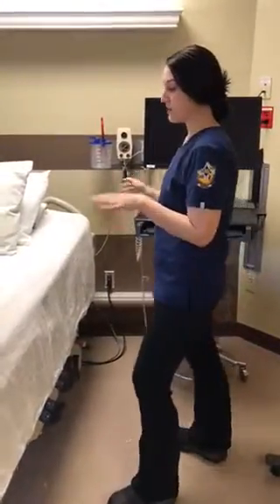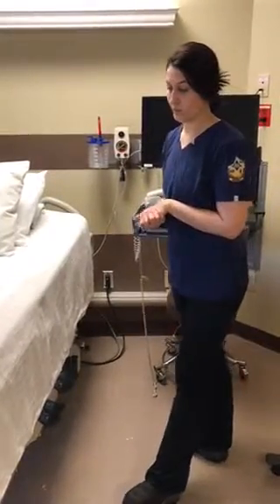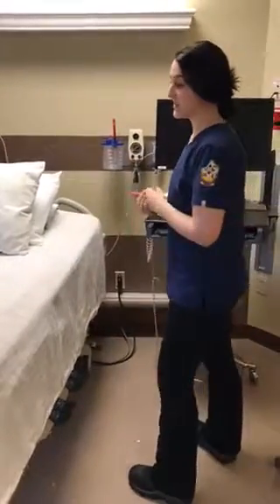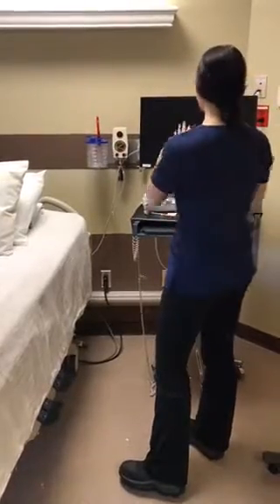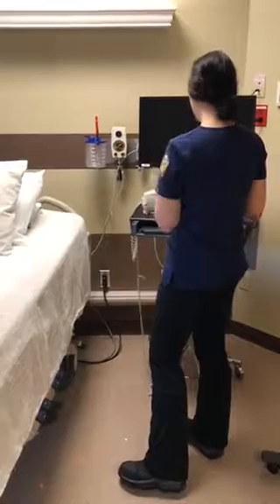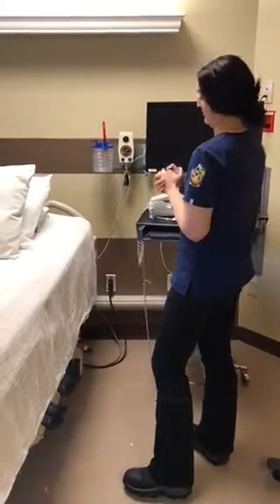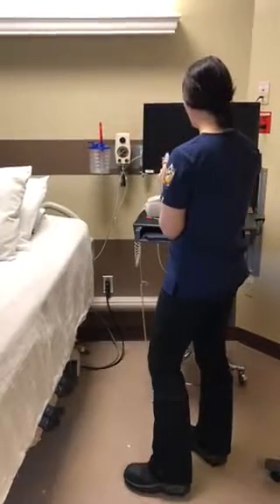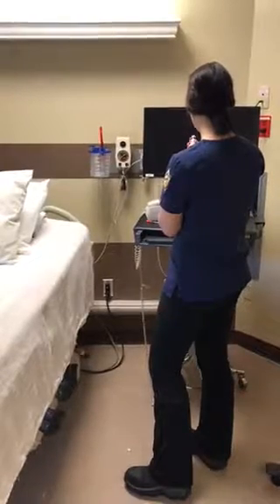Bob, can you give me your name and date of birth? Bob Janssen, January 30th, 1945. Okay, so you pronounce it Janssen. Yeah. Okay, perfect. So I'm going to check that on the MAR. Dr. B, Bob Janssen, correct. And his date of birth is on there correctly. Bob, do you have any allergies? No. Okay, and I don't show any on the MAR as well. And again, I show the 10 units of the Humulin R U100.